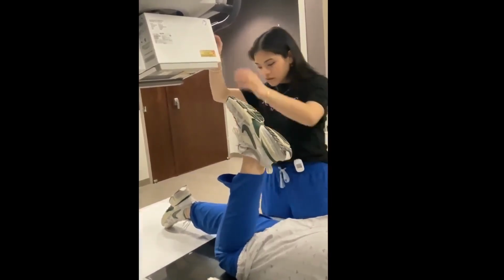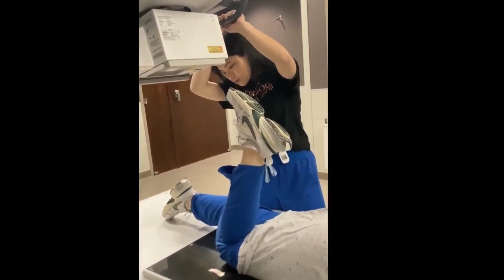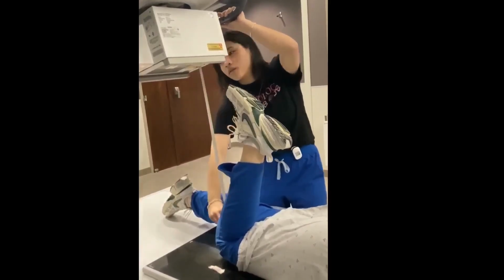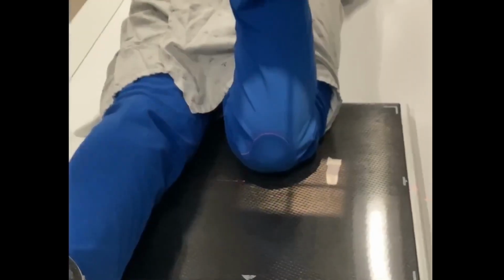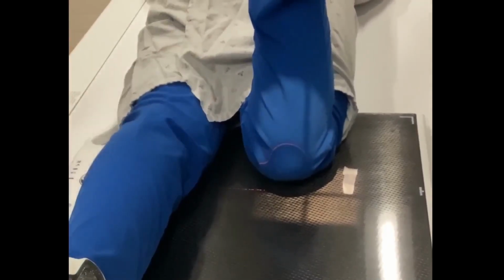The patella is positioned perpendicular to the IR with the femur and tibia angled due to knee flexion. Ensure that you collimate to the patellofemoral joint space only and that there is a 40-inch SID. Mark the affected side. No shielding is used to avoid obscuring anatomy.